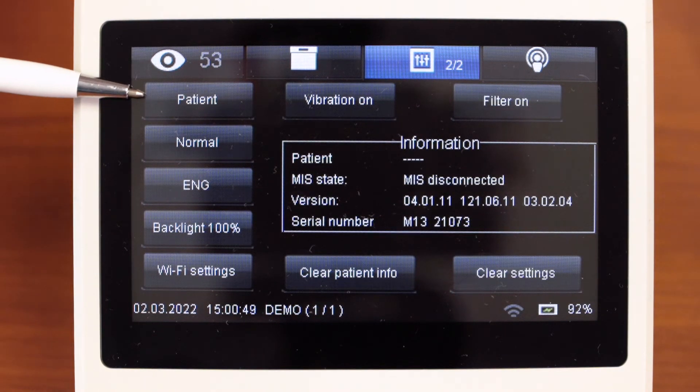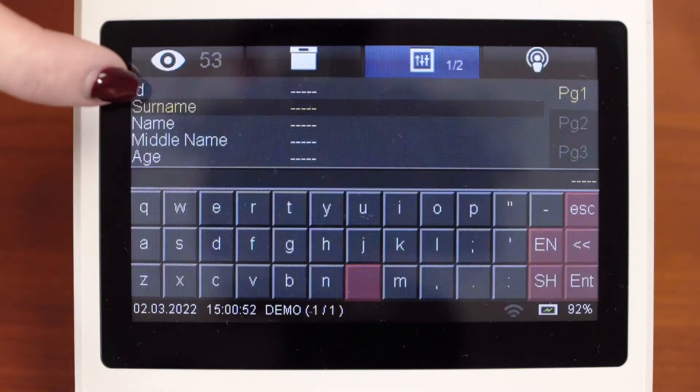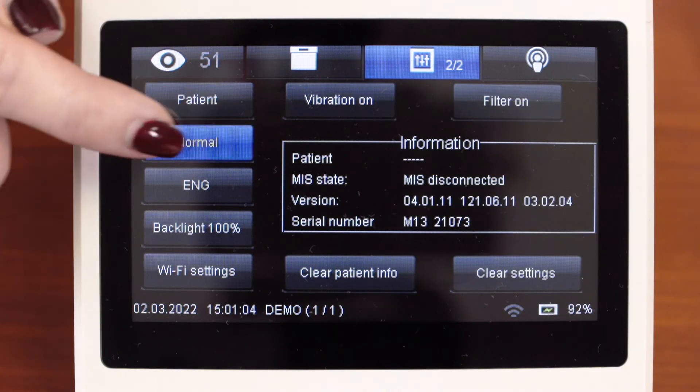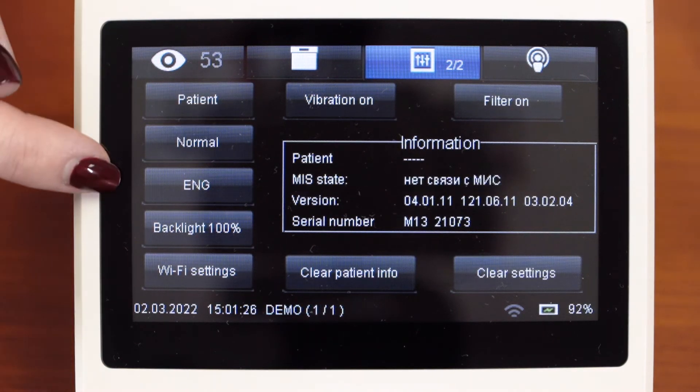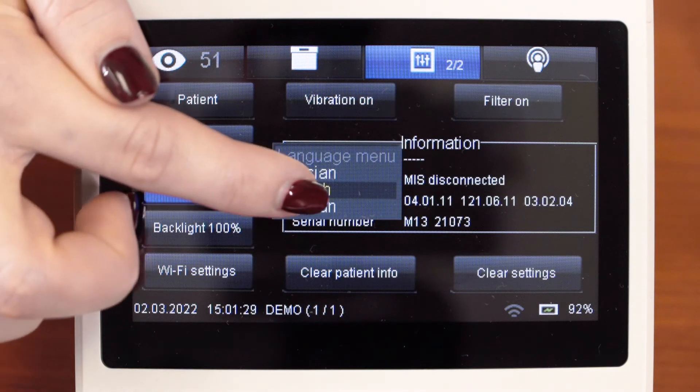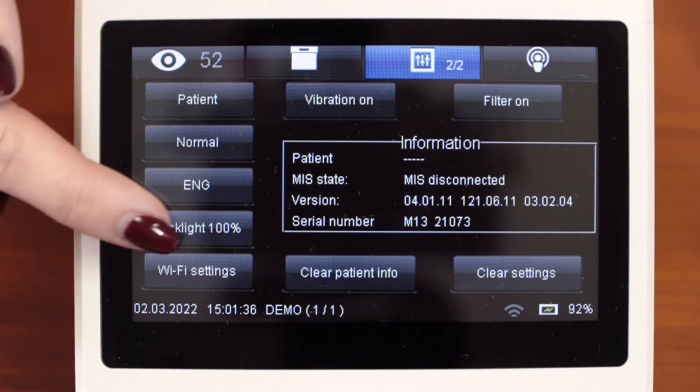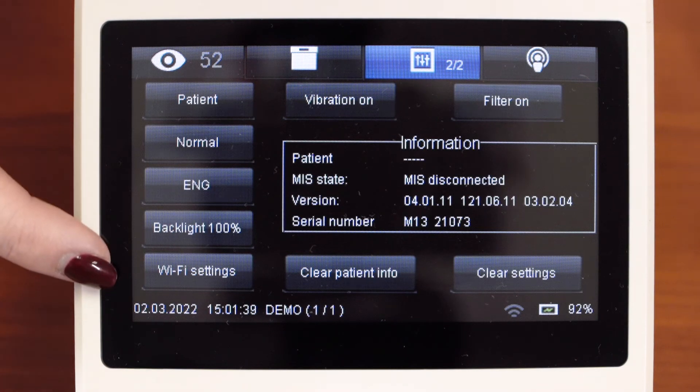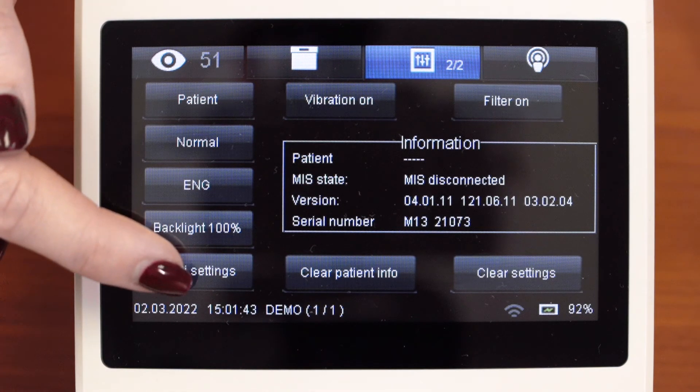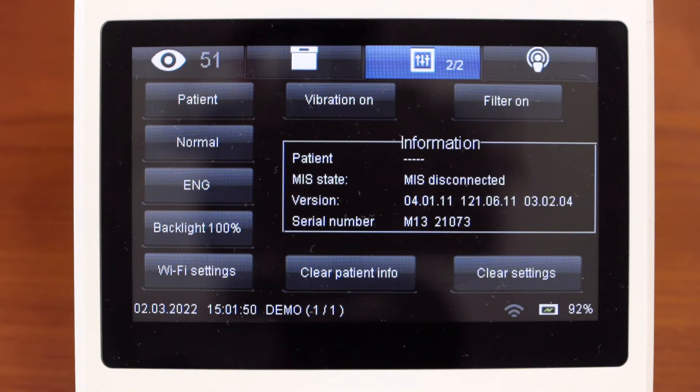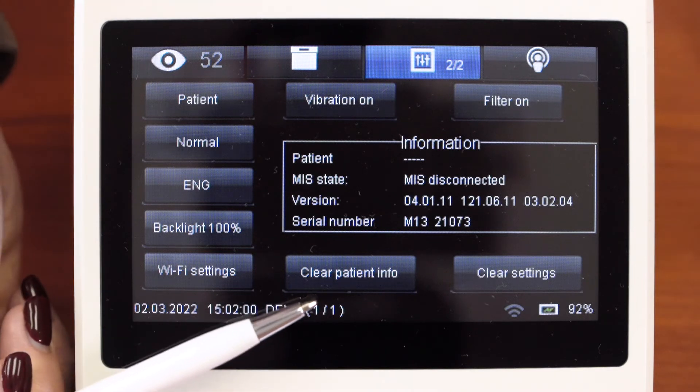Here you can set the information about patient. Here you can turn on normal or demo mode. Here you can choose the language. Here you can set the brightness of display. Here you can use Wi-Fi connection. Also you can turn on vibration of device and power filter. Here you can clear settings and clear patient info.